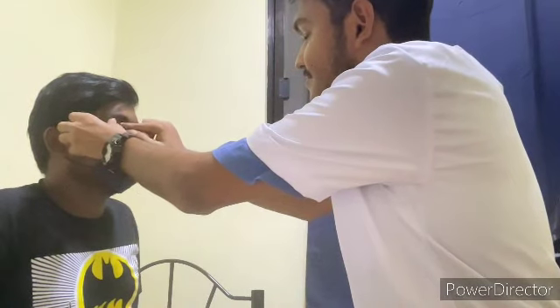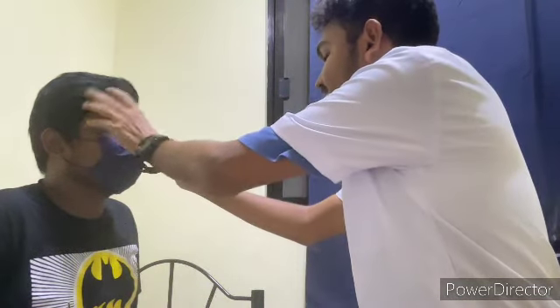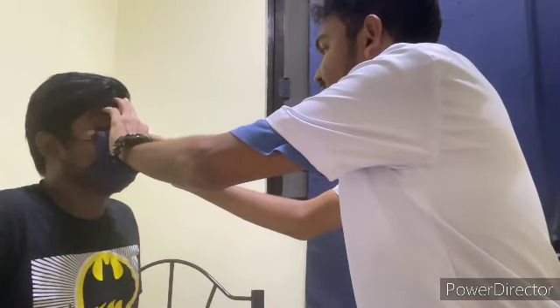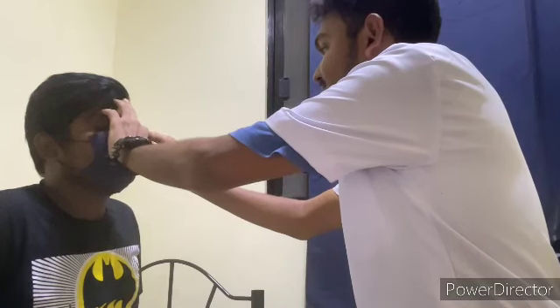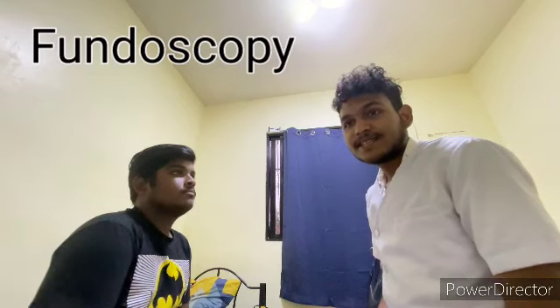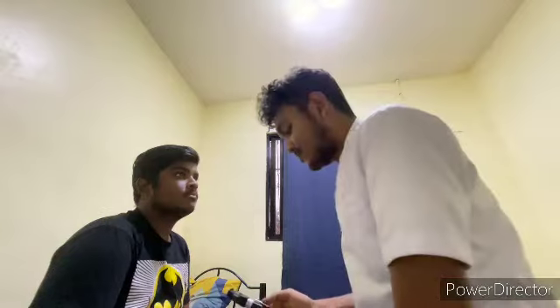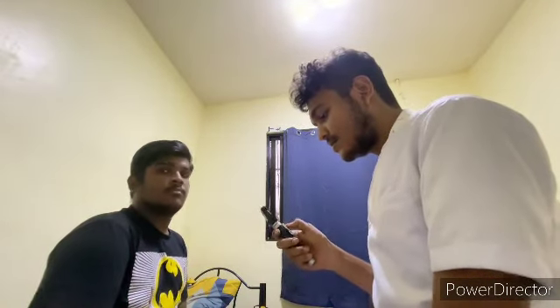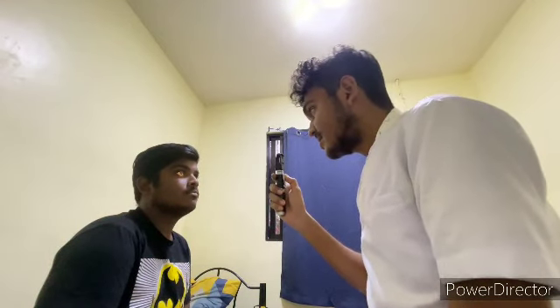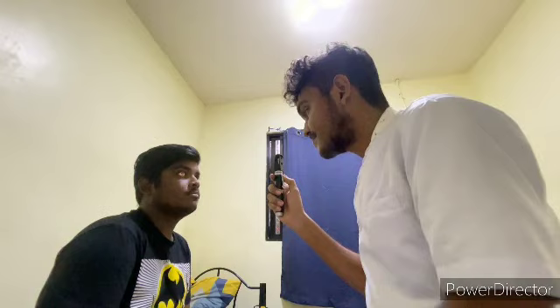We have to palpate the eyelids, look for any masses or an increased IOP. So the final examination is a fundoscopy examination using an ophthalmoscope. We have to put the dial at plus 8, and we should be approximately 1 foot away from the patient with the ophthalmoscope. See if the light is working, and first we should see if we can see the red orange reflex in the patient's eye.